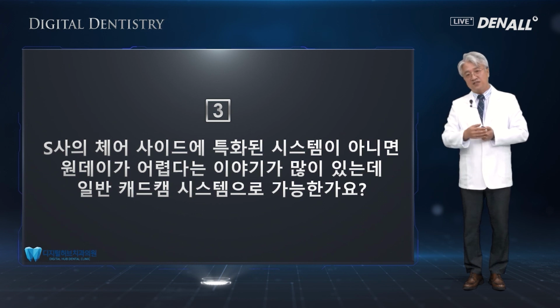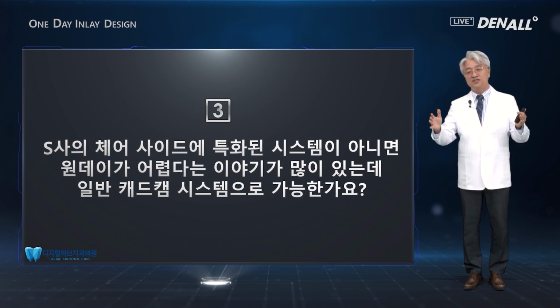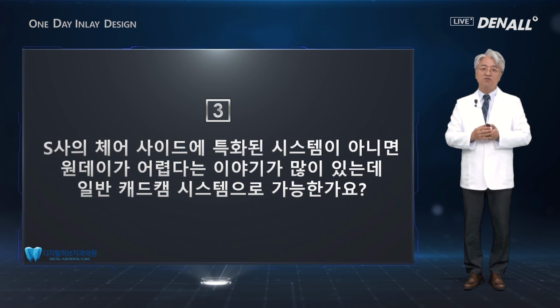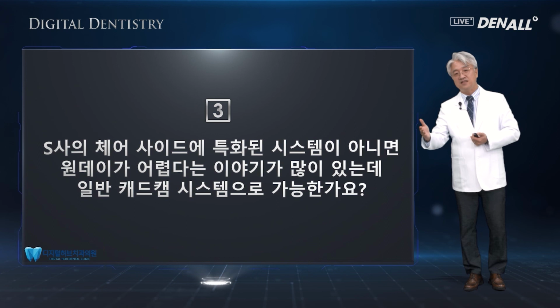But with those chair-side systems, I think the disadvantage was that the scalability or expansion in clinical cases was limited, so you cannot have everything, and that made it really challenging.